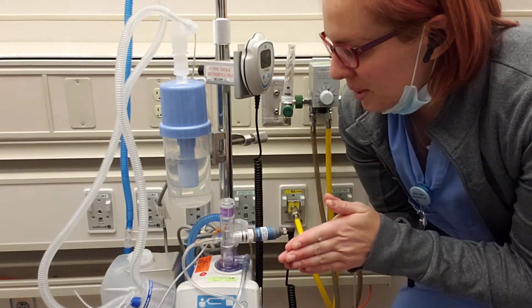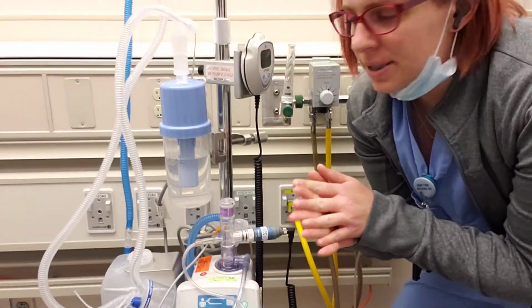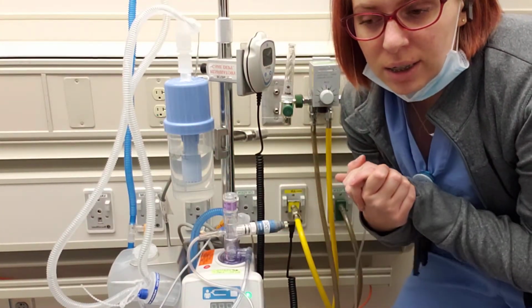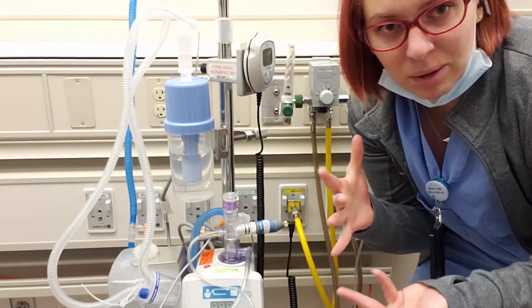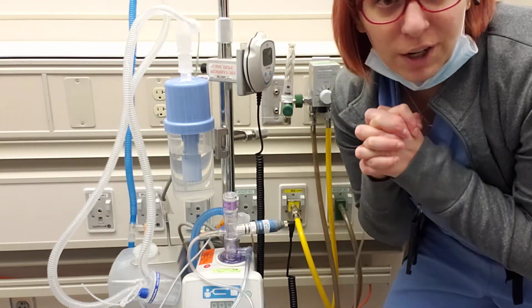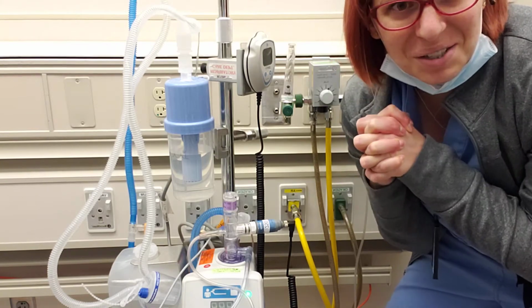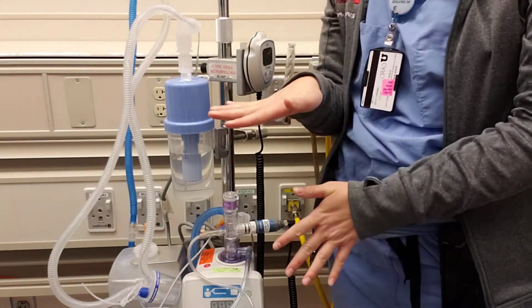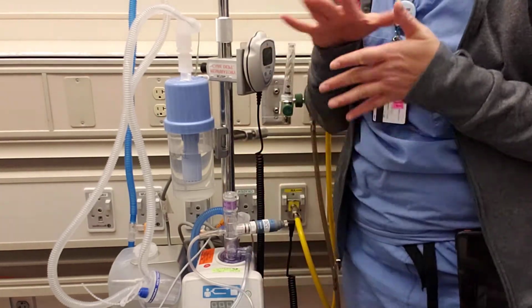A few things with bubble CPAP that they have found is not only are we giving that additional pressure that we want to help maintain the alveoli open, but the bubbles also give an oscillatory effect, which is very beneficial for these brand new lungs. So that's kind of the theory. Now I'm going to run you through the practice.